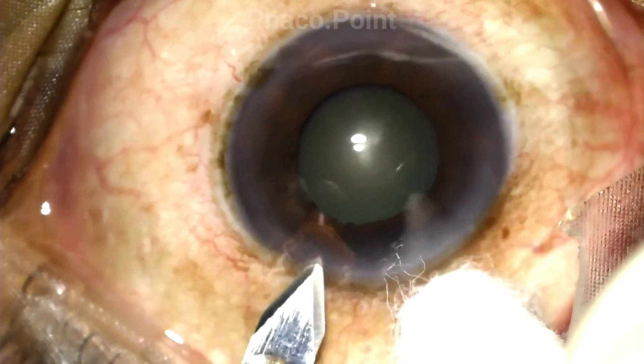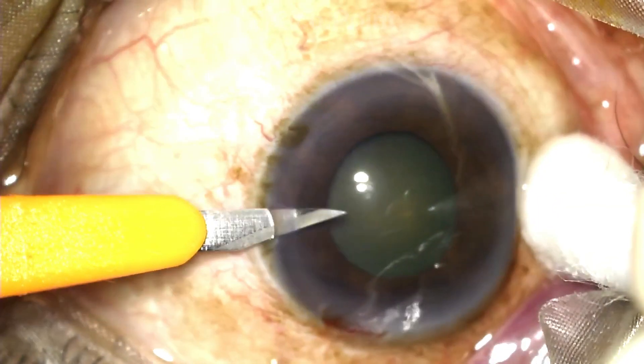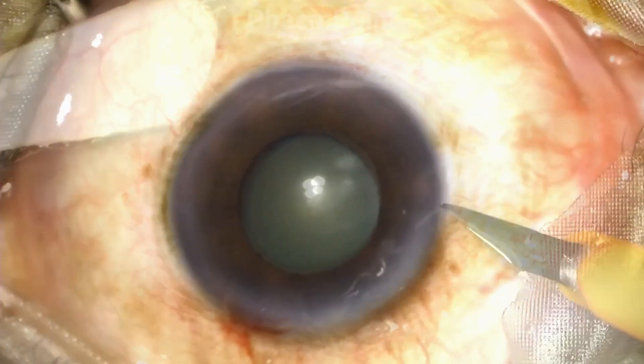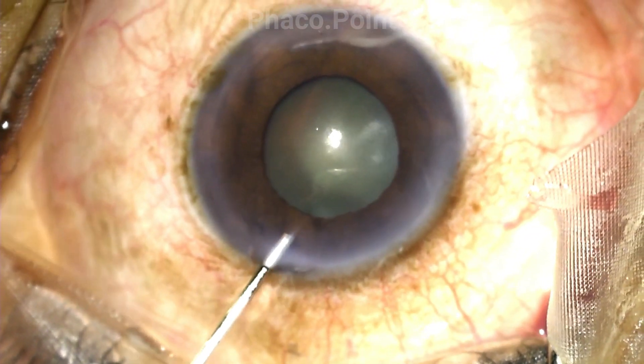Since we know we are going to be dealing with certain challenges because of the small pupil, it's very important that the initial steps — that is your incision, your rhexis, and hydro — should be flawless. For example, you don't want an incision that is too narrow, which could result in difficulty negotiating instruments with an increased chance of damaging the iris. Neither do you want an incision that is too large, which could allow the iris to prolapse out. We need to ensure that at all steps throughout the surgery, we do not accidentally damage the pupillary edge.